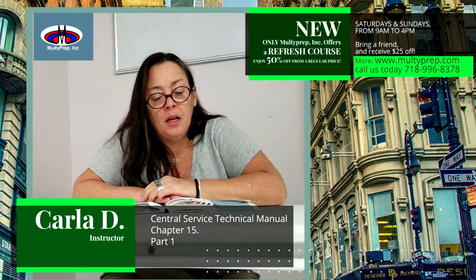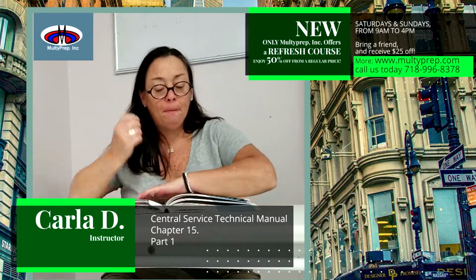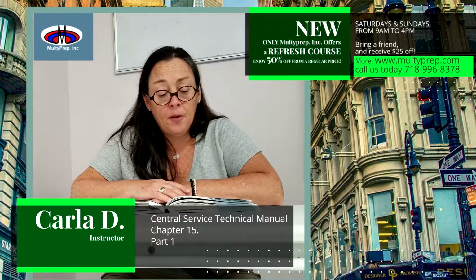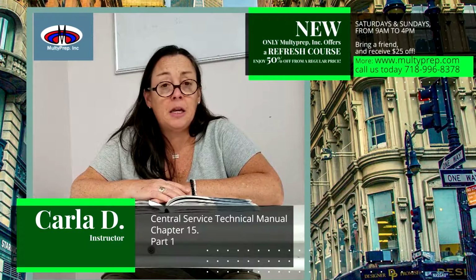Efficacy. EtO has an excellent microbicidal activity. During the alkylation process, EtO destroys the cell's ability to metabolize or reproduce, which leads to the organism's death. Penetration. EtO is a small molecule that vaporizes easily and can permeate a wide range of materials, including plastics, to reach recessed areas. It has a high vapor pressure and a low boiling point of 51.3 degrees Fahrenheit, or 10.7 degrees Celsius. As a result, it is easily maintained in the gas phase.